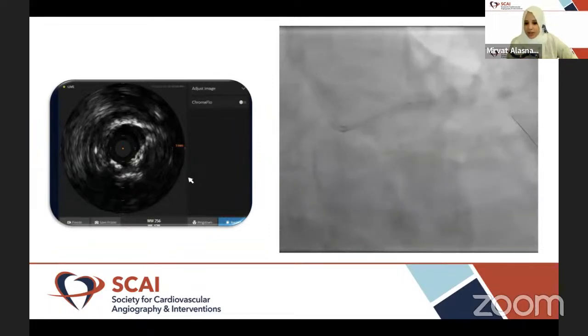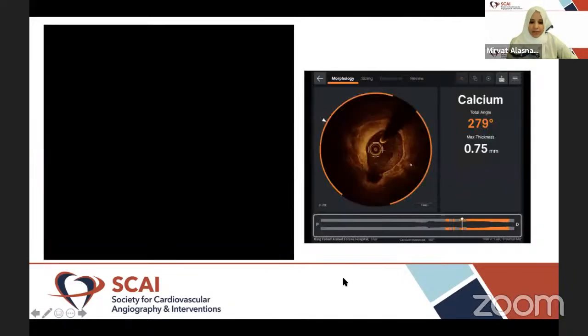We were a little better aligned when we managed to get the OCT catheter. I mean, it's open to the panel, of course. It does appear that OCT catheters are perhaps smaller, but they are also very flimsy and not very supportive. So sometimes they're more difficult than IVUS to deliver. So I don't think it's about size. I really do think it's about the guide catheter, whether we had a buddy wire or some sort of support to help us deliver.